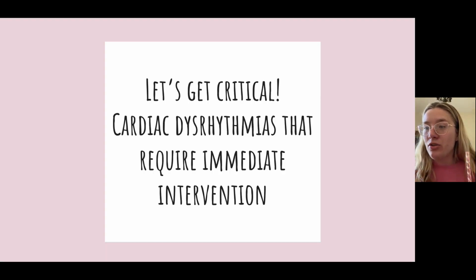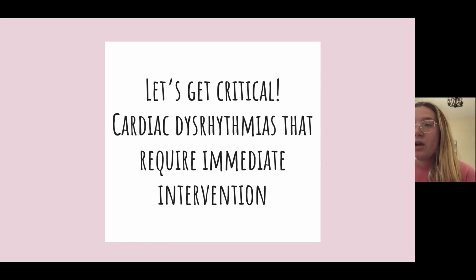So that concludes the Medsurg 1 cardiac EKG interpretation portion of the lecture. Now we are going to move on into our critical care portion of our EKG interpretation. Okay? Okay, so again, this is going to be our critical care portion of our presentation.